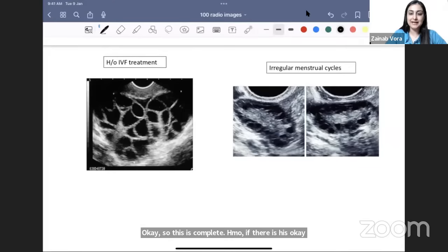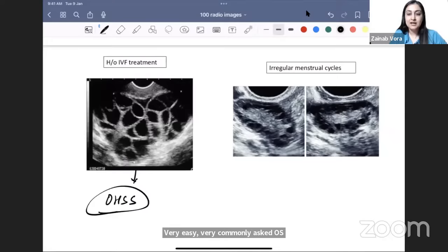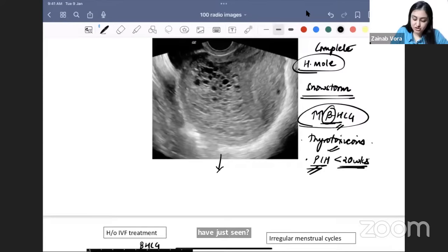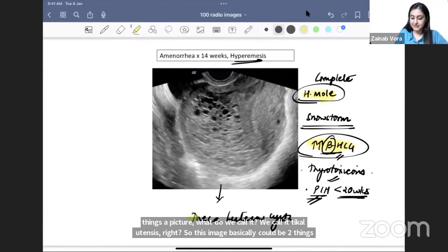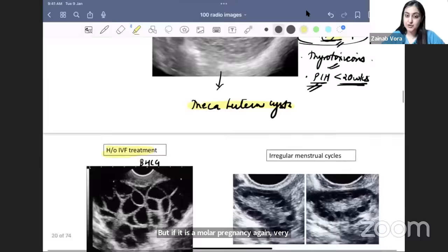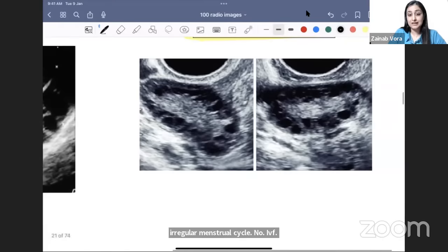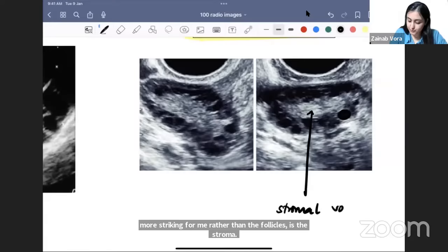Two cases of enlarged ovaries: if the history is IVF treatment with very large follicles, the diagnosis is OHSS — ovarian hyperstimulation syndrome. If the same image appears in a case of molar pregnancy with very high beta-hCG, we call it theca-lutein cysts. Same pathophysiology, but different context: IVF history means OHSS; molar pregnancy history means theca-lutein cysts.